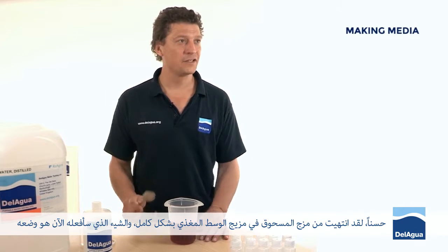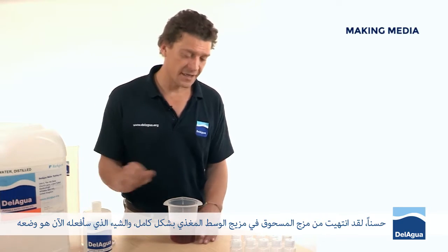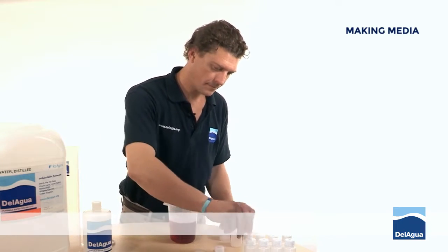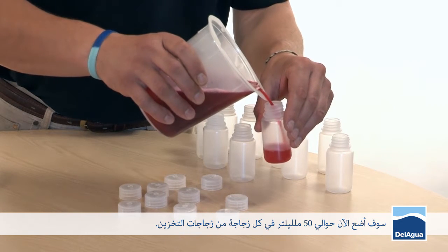I've now finished completely mixing the powder into the media mixture. What I'm going to do now is decant it into the storage bottles. I'm going to pour about 50 millilitres of media into each of the storage bottles.